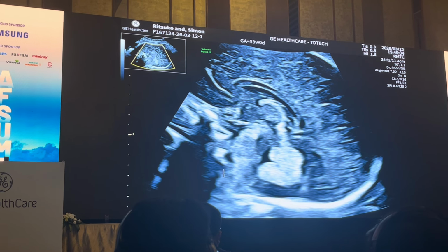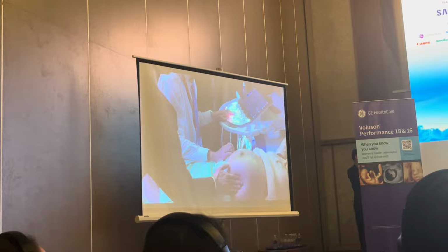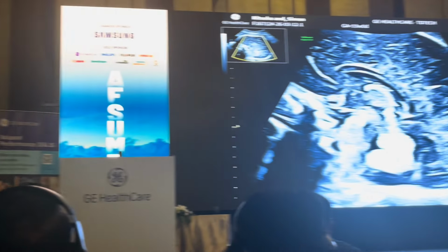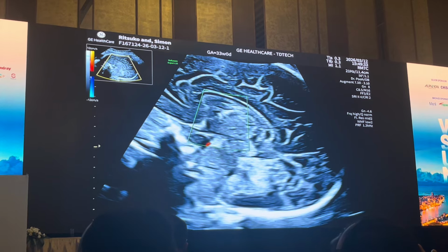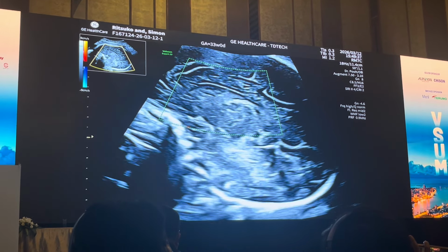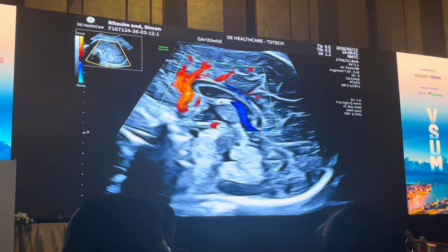I do not measure this. This is a routine screening evaluation, but if you do want to measure, there are a number of charts. You can measure from outer to outer, or you can measure inner to inner. When I'm in that position of looking at the pericallosum, I can choose color Doppler. I reduce my box until it's a very small size, and I reduce my PRF, increase my color output, and increase my color gain to catch the pericallosal artery.